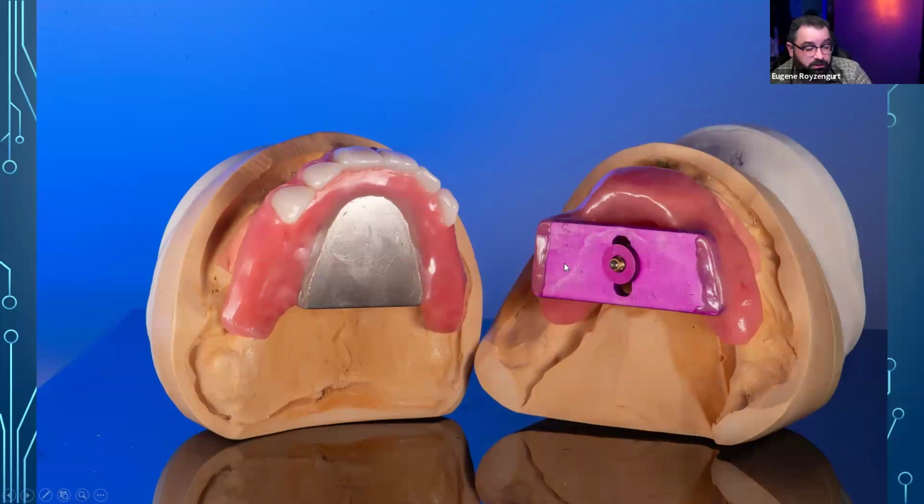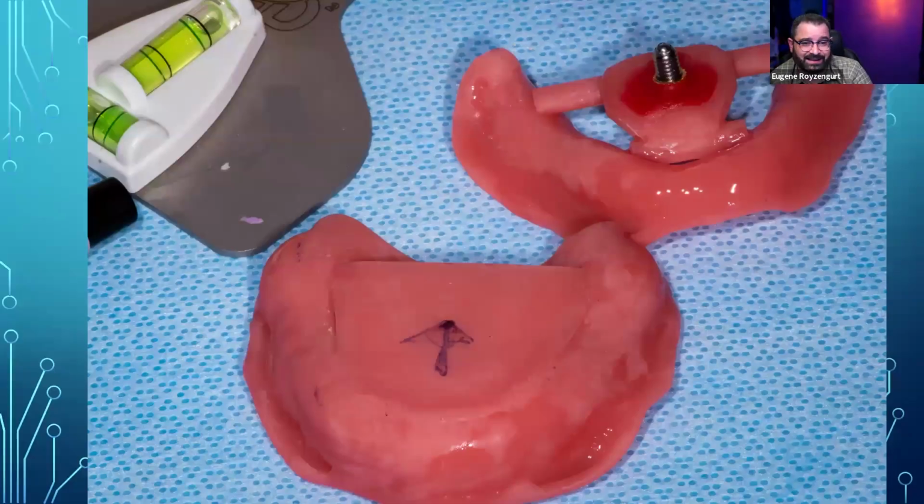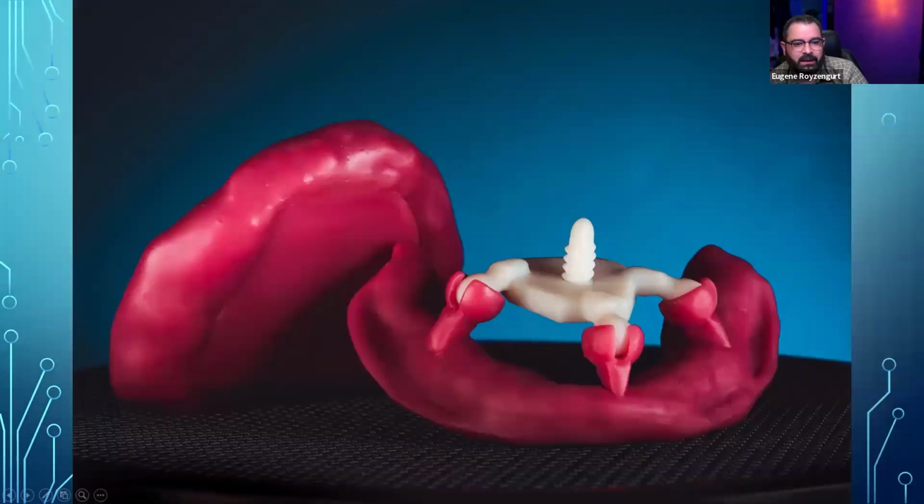So what I tried to develop, with a little bit of help, is a digital version of the Gothic arch tracer that I can actually print for every single patient. In the beginning, we used to do the screws, the metal ones, to build in. But then I designed it this way, where my buddy Mark gave me a file for a screw, which was digital, and I built the whole thing around it. And I have the plates, and I can actually snap this in if I need to. I don't do this a lot. I usually just attach things quickly.